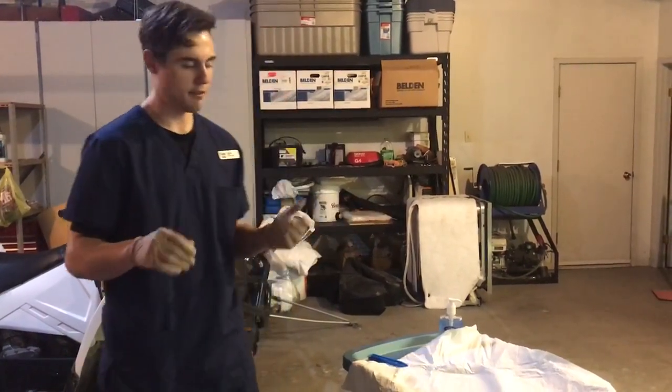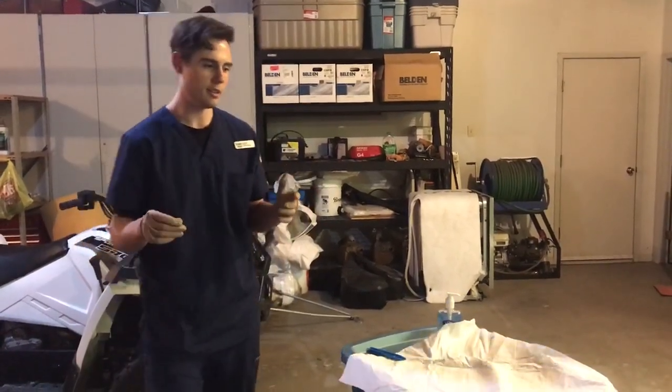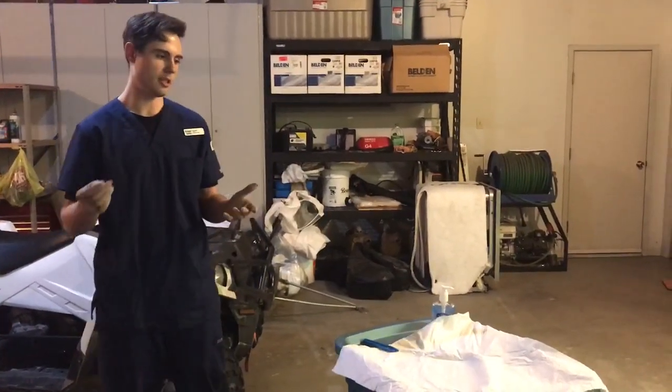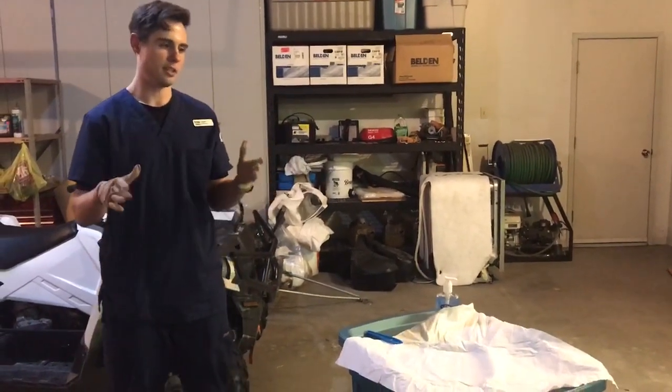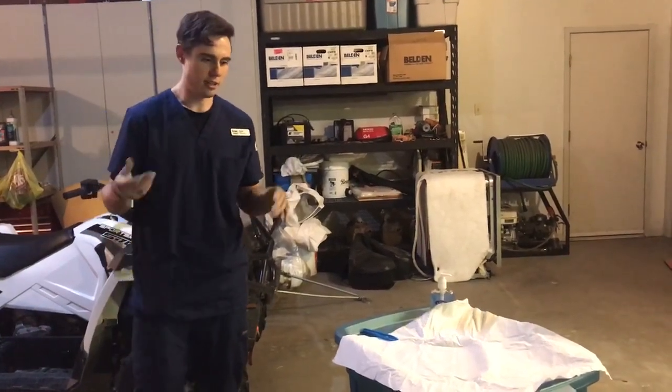After that, after I have my supplies, I'm going to enter the patient's room. Upon entering, I'm going to do my entry safety check, so make sure the bed's in the lowest position, call bells within reach, patient's in no distress, the appropriate side rails are up, and then I'll introduce myself.